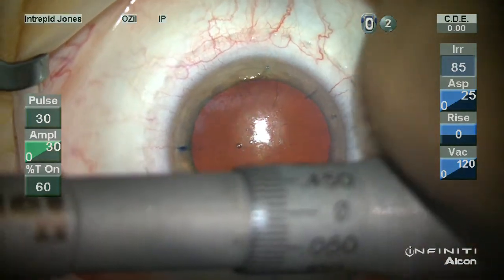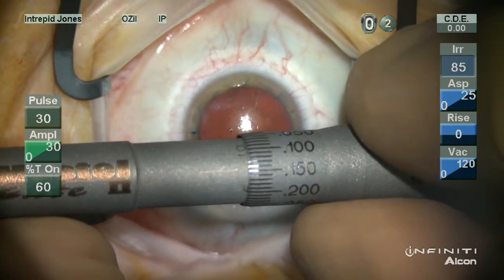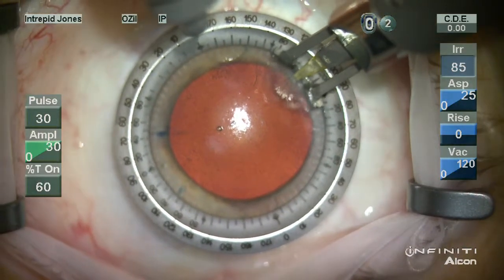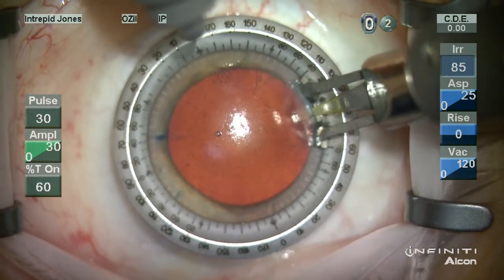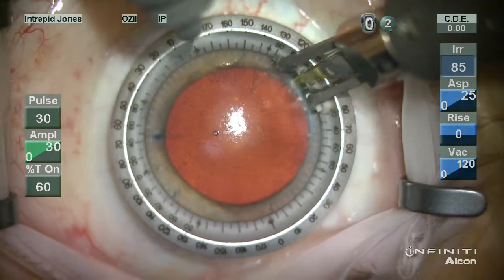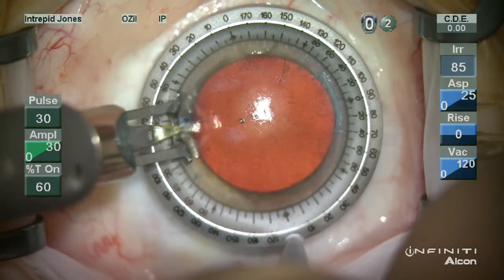Now it's important to look at the 0 mark to ensure that your blade does not extend beyond the foot plate prior to advancing the blade to the desired depth. And it's important to rotate the barrel up to the desired depth marking and not go past it. If you've gone past, go back down and come back up. The blade is then plunged into the corneal tissue at the mark. I like to incise towards me, so I'm dragging this blade towards me. And if you have to do a little touch-up, as can be seen here, go back in. Sometimes it's helpful to lift and reset down in just to get a little bit extra depth and length.